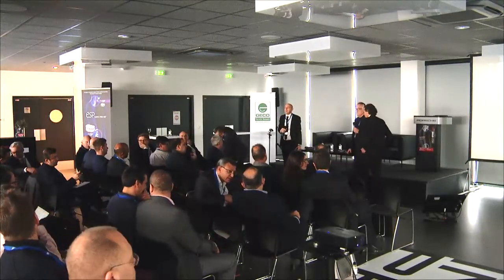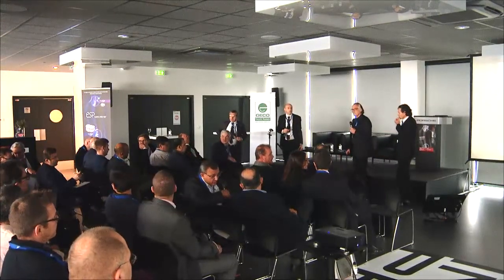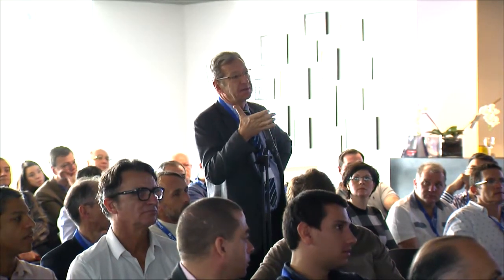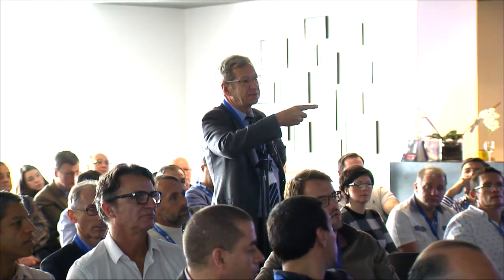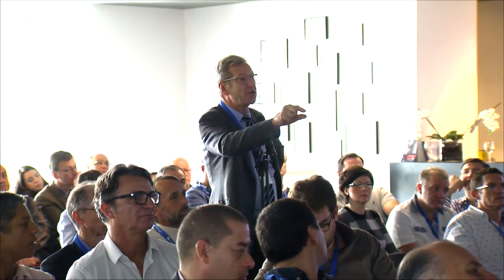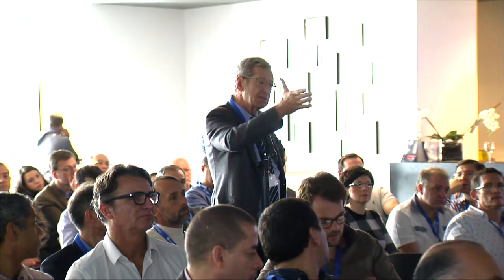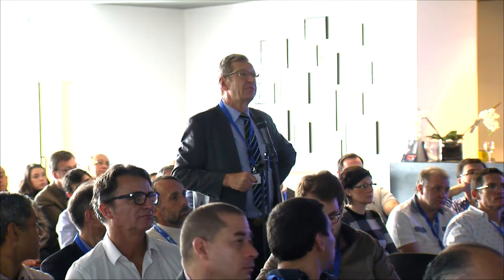When you do the lateral approach, you have some asymmetry because you cut the ligament or the annulus on the left side. You don't cut on the right side. And as I saw, you don't cut in the front and you don't release in the back. So you have only one hole, and in the picture we have seen, your prosthesis is a little in the front, perhaps not enough at the bottom of the disc.